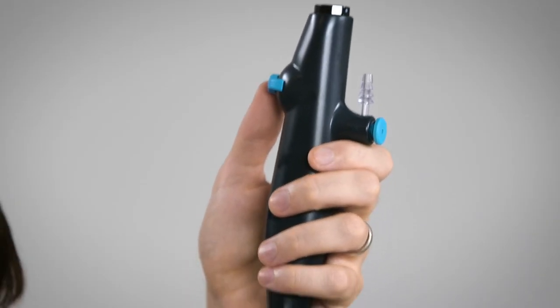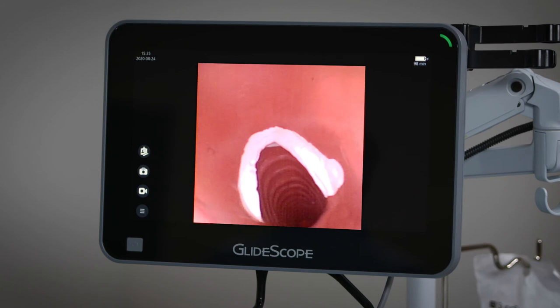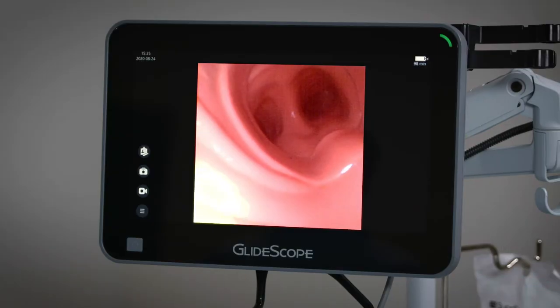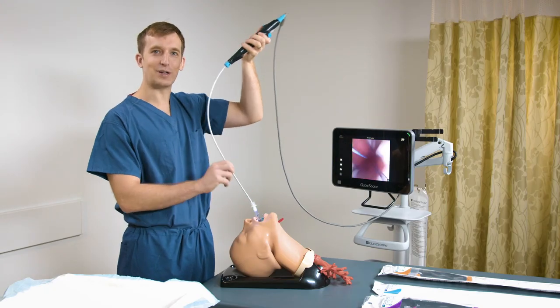You'll notice that my thumb is on the lever, controlling the tip of the bronchoscope, and I keep the insertion tube as straight as possible to avoid kinking at the handle. We're now entering through the vocal cords and into the trachea. I'm ready to insert my endotracheal tube. Once I confirm the position of the tube, I'll have an assistant inflate the cuff and my procedure is done.